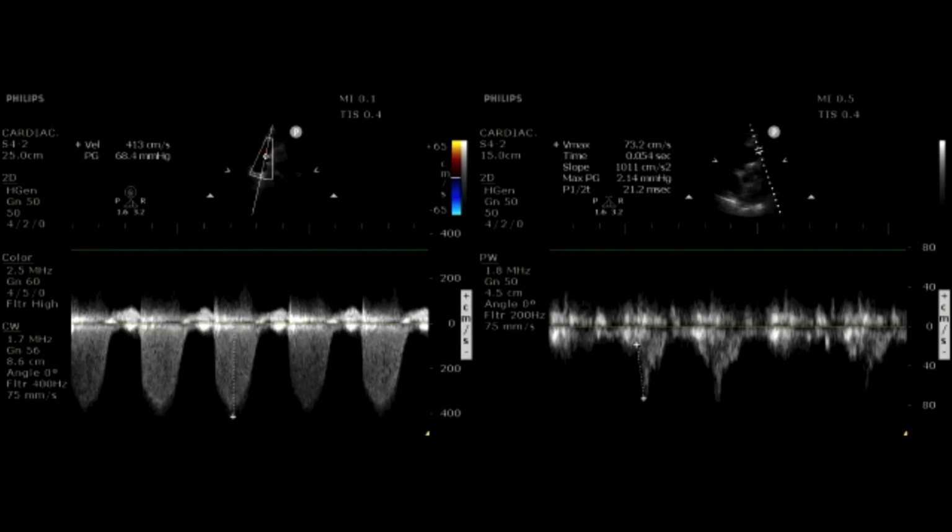But then from there, there's a whole spectrum of, what should I do with this patient? Can I safely send the patient home on anticoagulants, or do I need to admit them for some reason? Or if they're crumping, do I really need to do something for them right now? And so I've looked at the echo, and maybe I could do some more with it, but I've looked at the echo as a prognosticator once I know the diagnosis. So for me, this is just more data to suggest the severity of the PE, like TAPSE: you give that number, and above and below a certain value, the mortality goes up or goes down.